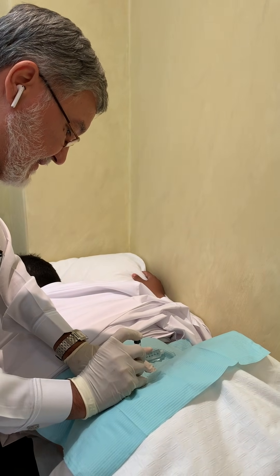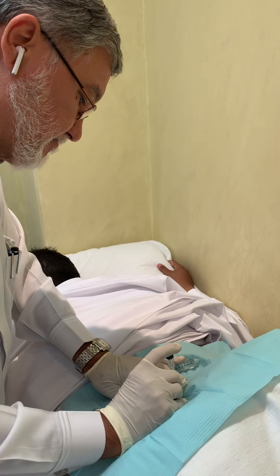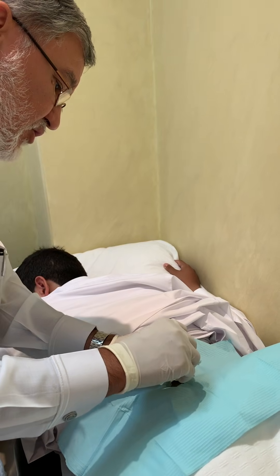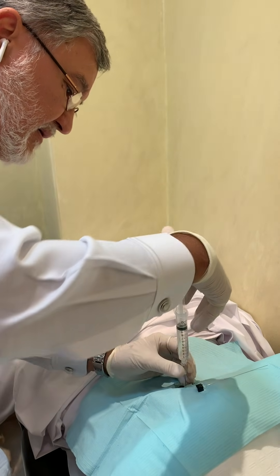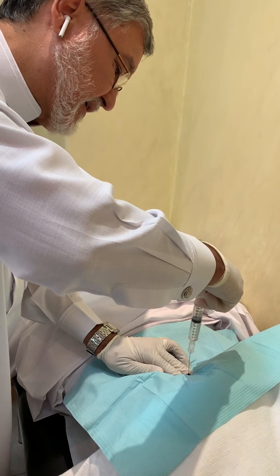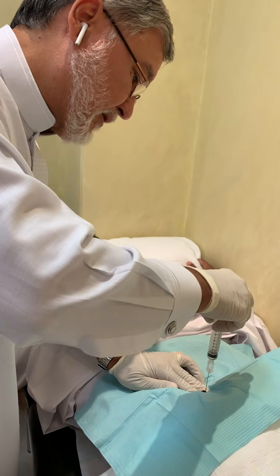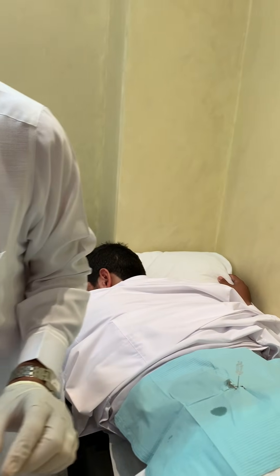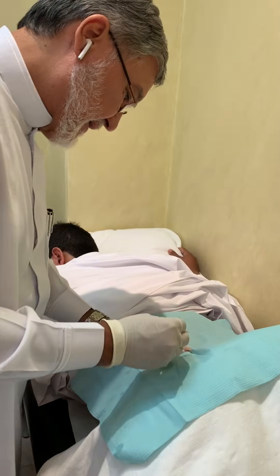The stylus is inside still. I try to reach the periost — yes, I am now on the periost. So I remove the stylus. The spinal needle — usually we can do it with the regular needle, but sometimes if the patient is muscular or obese we cannot. So I'm injecting now local anesthesia on the periost, and of course a little bit will diffuse into the subcutaneous tissue, but as I said the subcutaneous tissue is not so important.